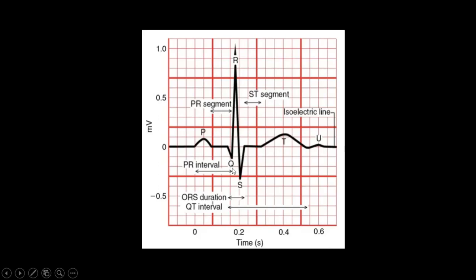Now, let's see the clinical significance. This is a normal Q wave, and whenever there is any deepening of the Q wave, that is, a deep Q wave along with other changes, it is an important sign of myocardial infarction.